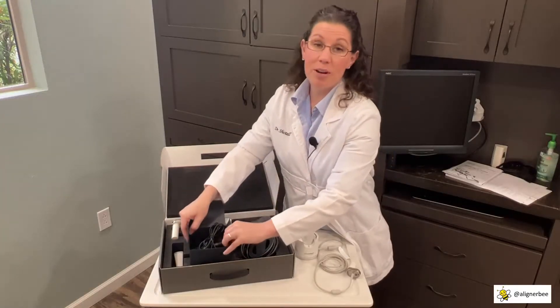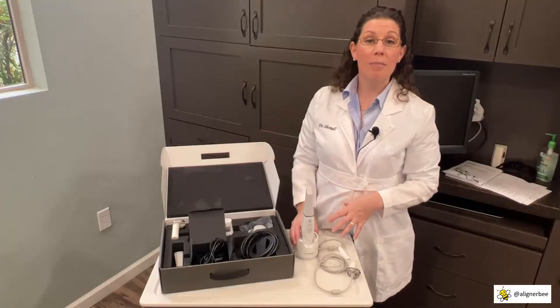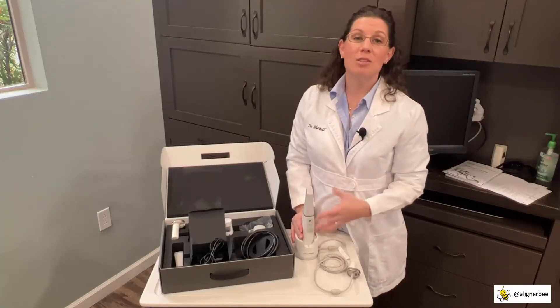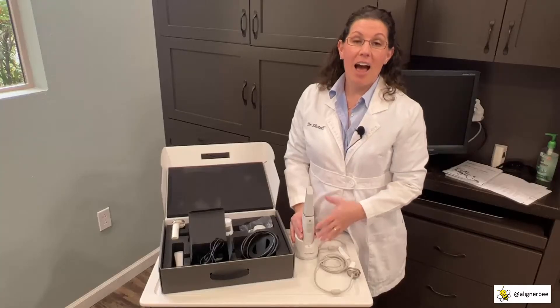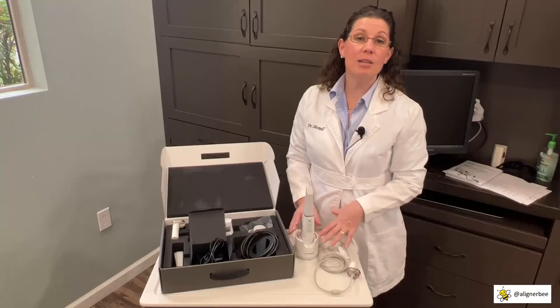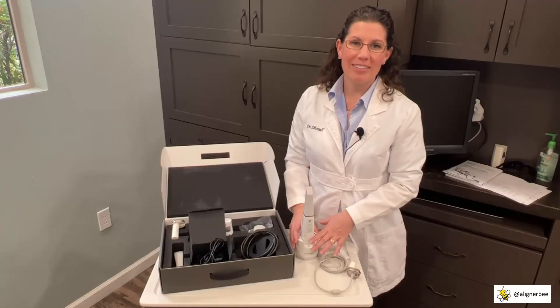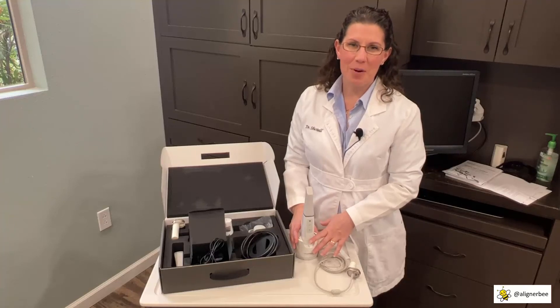I'm ready to begin assembling the scanner, connecting it to the laptop, and getting the batteries charging so I can use it with my first patient. I'm going to bring over a small cart because I like to keep everything mobile in my offices, and we're going to assemble the new scanner on the cart.